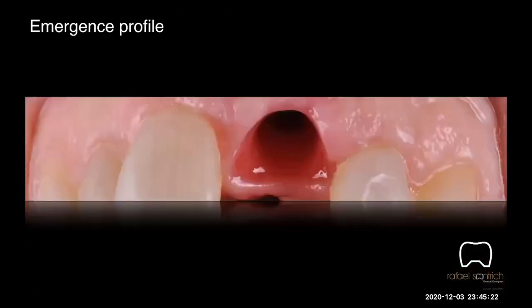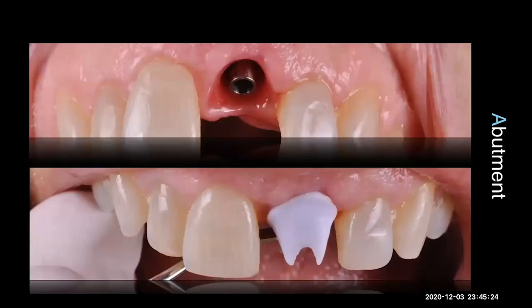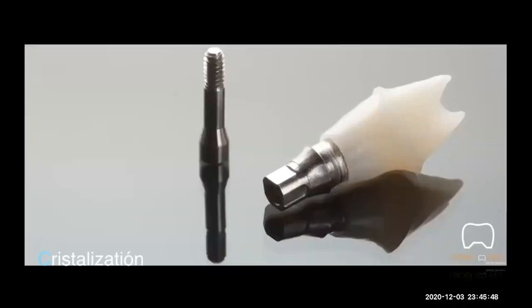Then we remove the temporary. We try it in. This is an academic picture, this is not the right shape of the abutment. This is only for teaching purposes, to show how the block looks before crystallization. Okay, this is the abutment already crystallized.